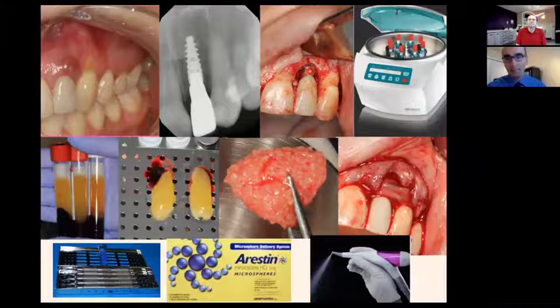suturization around this implant. In my practice, we do the concentrated growth factors. We do a little bit of venipuncture to centrifuge the venous blood of the patient. And what it does, it separates your venous blood into 3 different categories. And this area is the area with platelet-rich fibrin, concentrated growth factors like PDGF, VEGF, all those good growth factors that help with soft tissue regeneration and revascularization of the wound. And these are the PRF membranes, and we use the sticky bone protocol, the bone after detoxification as much as we can, decontamination with hand curettes, ultrasonic and airflow abrasion, then the GBR is done.